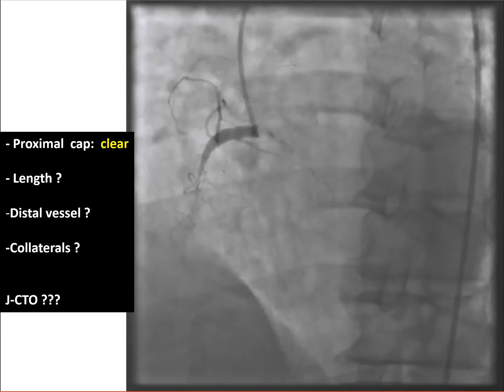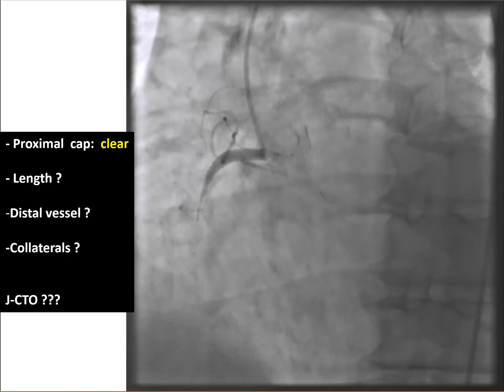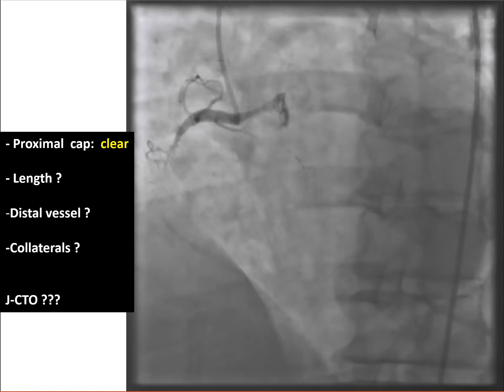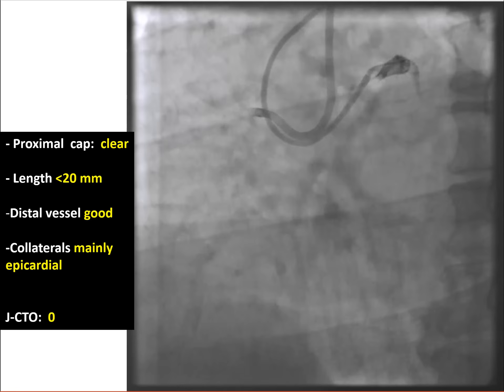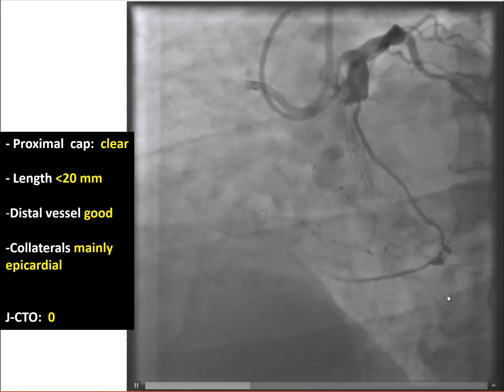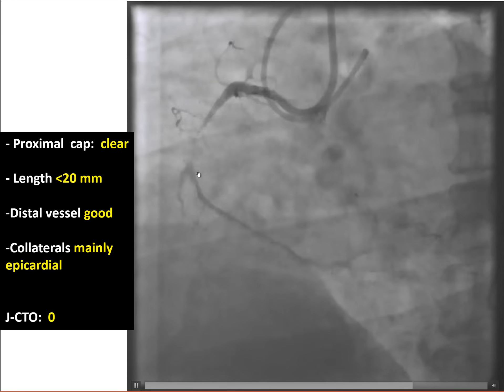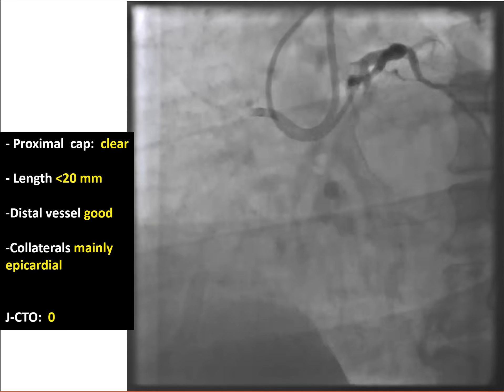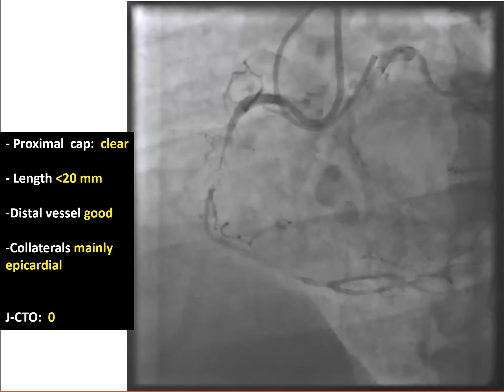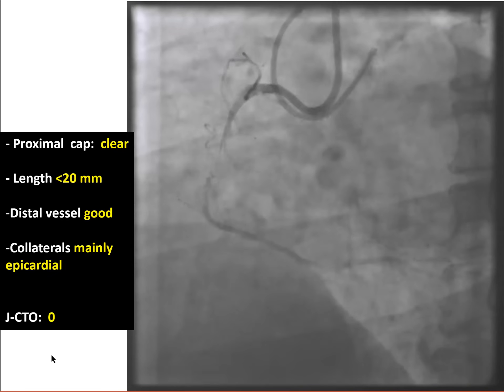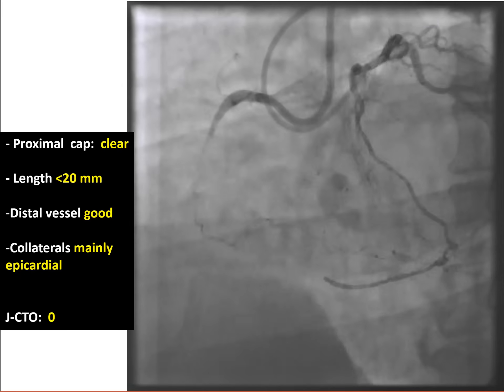This is an example of a right coronary artery CTO with single injection. It's hard to fully appreciate because the only thing we can see is a clear proximal cap, whereas the length, the distal vessel, and the collaterals are unclear. However, once we do a dual injection, it is now evident that the distal vessel is of good quality and large caliber, that the occlusion is short, the collaterals are mainly epicardial, and the JCTO score is zero, suggesting the vessel would be easy to cross — as was indeed the case in this patient.